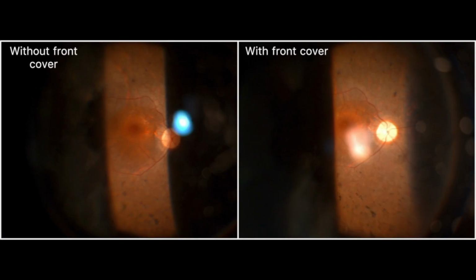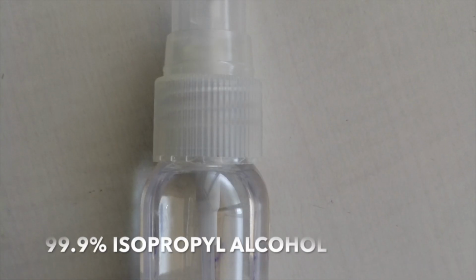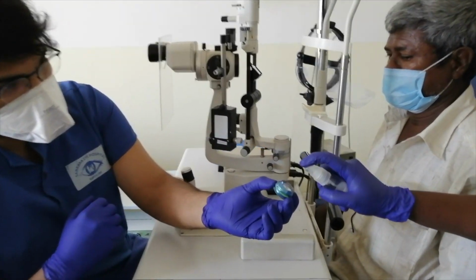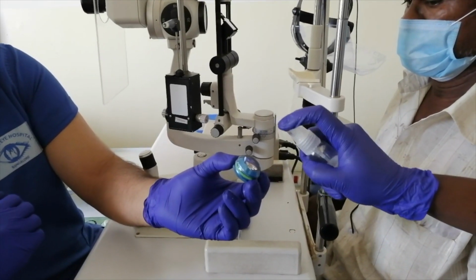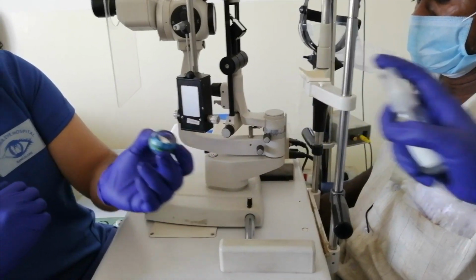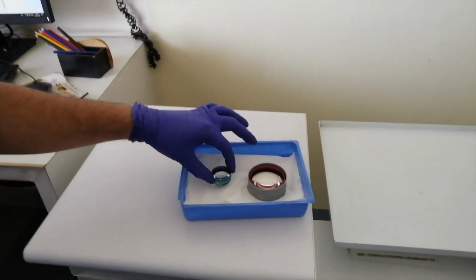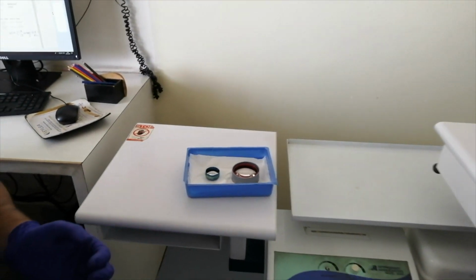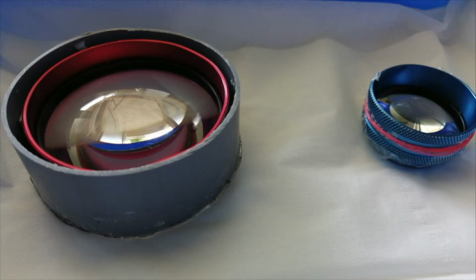This is a picture showing the comparison between the image quality of a 78 diopter lens without and with the front cover. After the examination is over, disinfect the front covered surface with isopropyl alcohol spray. The lens surface is not wiped to avoid any marks. The lens is kept back in the box layered with tissues. As the tissue gets soiled, the topmost tissue can be removed and the process repeated subsequently.